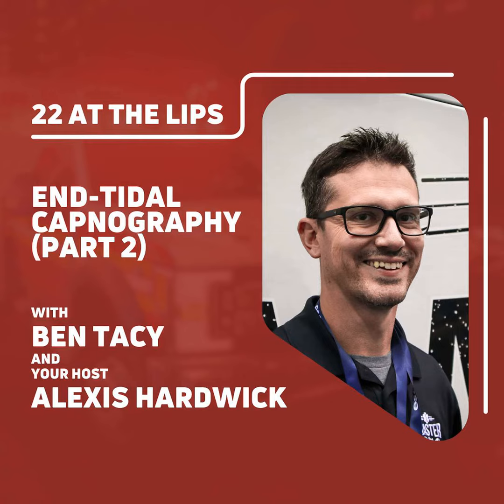Okay, so now we see that slow exhalation of CO2, and we know, hey, the exhalation phase is the issue. So we get that classic shark fin appearance on our capnography, and we listen to lung sounds and, yep, we've got wheezing, which correlates with that. We've got a relevant history, or maybe we don't hear any lung sounds at all. We can't really figure out what's going on, and then we see that shark fin. Oh, yep, that's a diagnostic tool. Absent lung sounds and a shark fin, probably status asthmaticus or significant bronchospasming, and we're going to escalate things a little bit more.